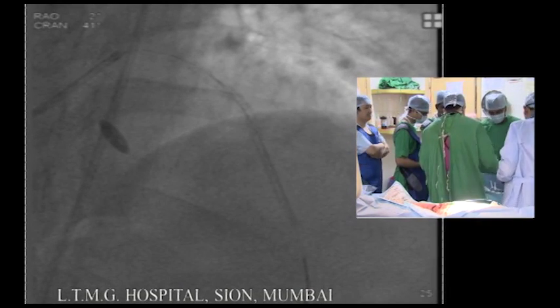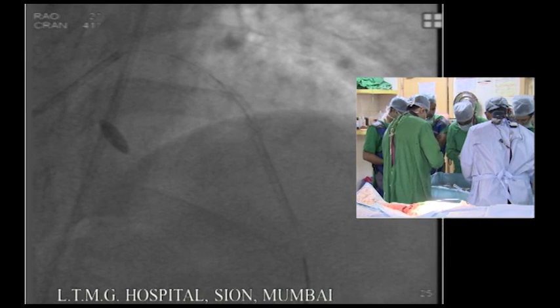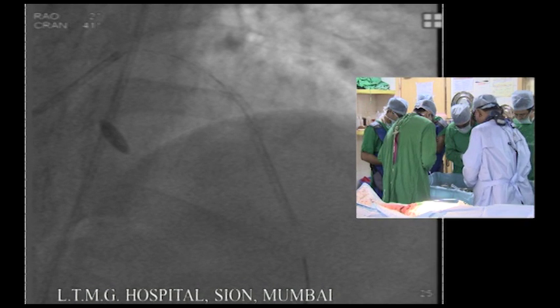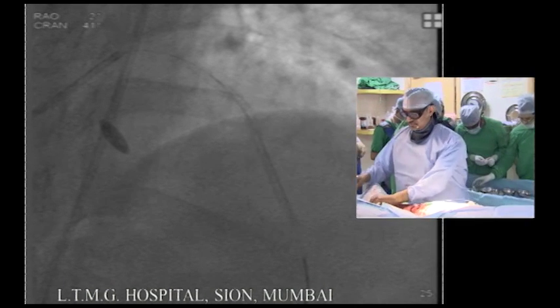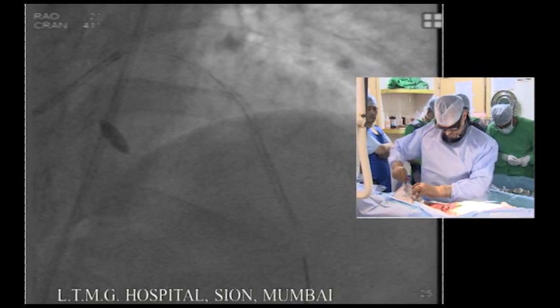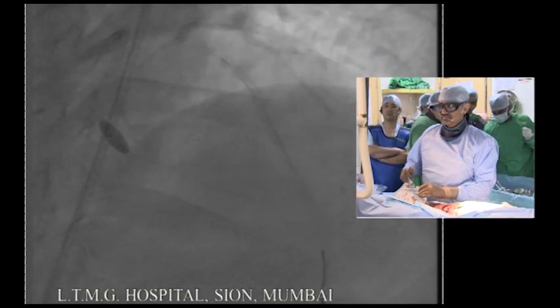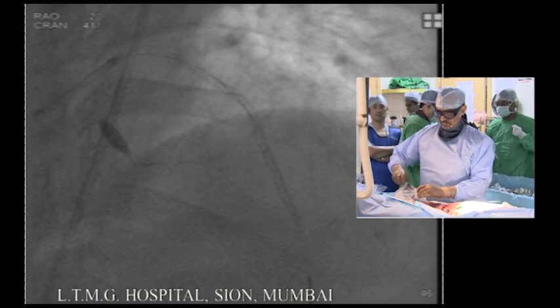Give me NTG. So whenever you have a lot of equipment, make sure that you flush it. Catheter thrombus is common. You always bleed back, and make sure there is no damping or suspect dissections. So these are the things that you should come into your mind.